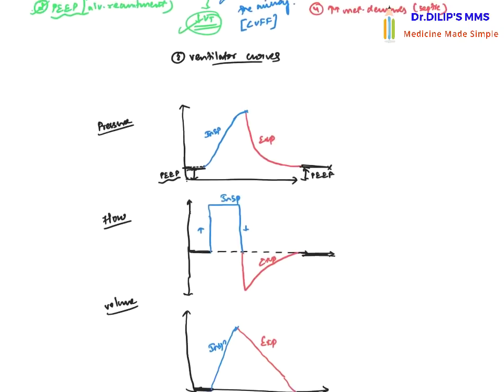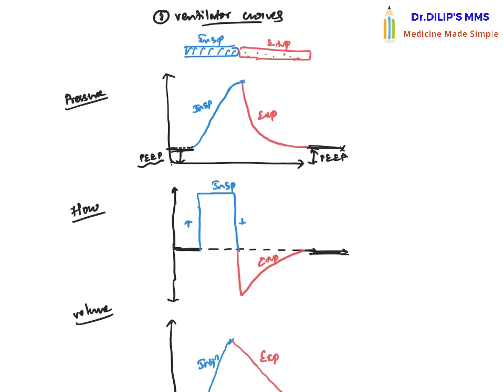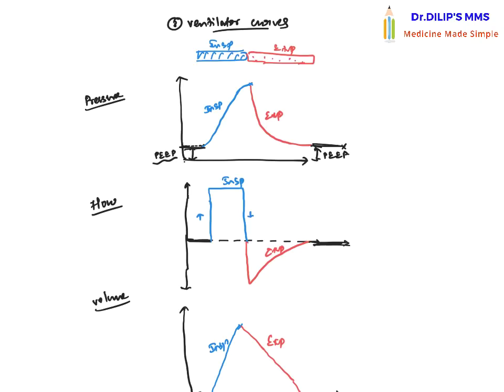If you want to equate this into proper mechanics, let us assume you have something called inspiration, which I draw in blue. This is the inspiratory curve, and next I can draw something called the expiratory curve. Even though this is not exactly accurate, as I told you, your expiration is generally longer than the inspiration, though there are a lot of ventilator modes. Anyway, this is a somewhat arbitrary diagram which I drew, but hope you understand. So this is inspiration, this is expiration in a cycle of breath.